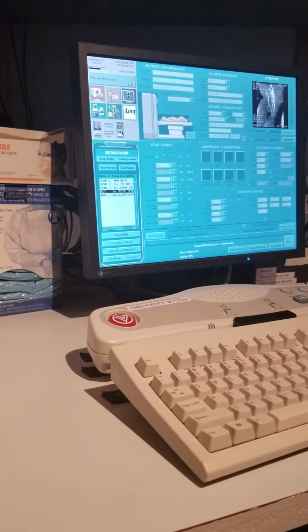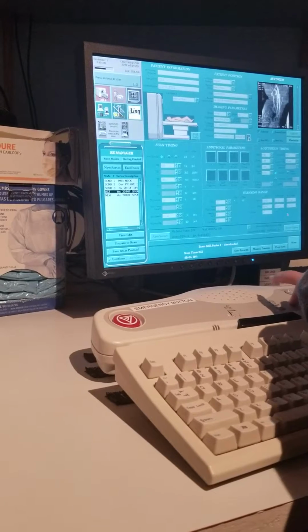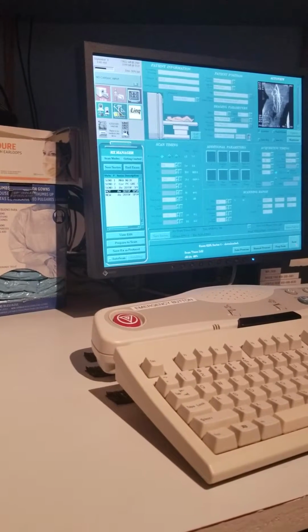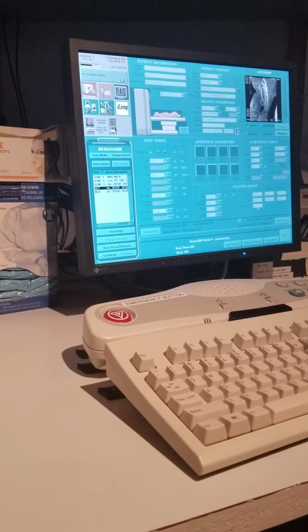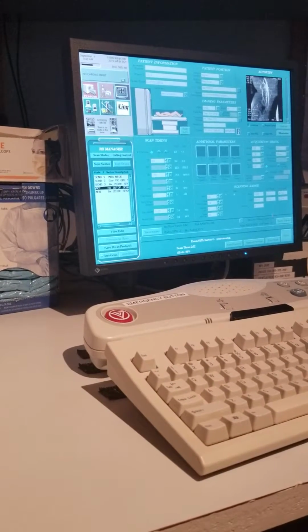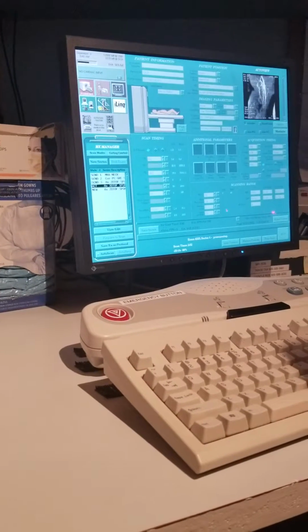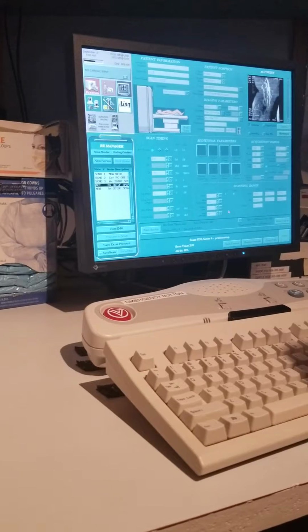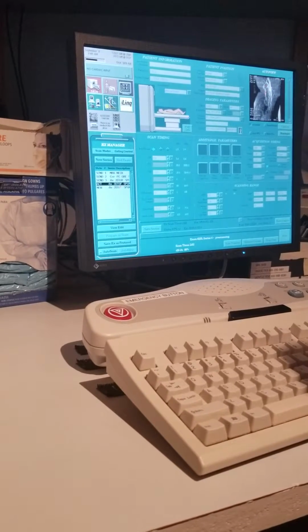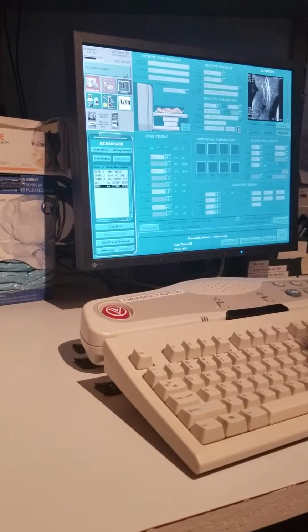Did we take out something to reduce the scan? No, we didn't. So 129 slices, 3 acquisitions. It's 3 slabs. It's a volume scan, so your total number doesn't have anything to do with what you're actually doing. So this is your collapsed image. Excuse me, this is your projection images.